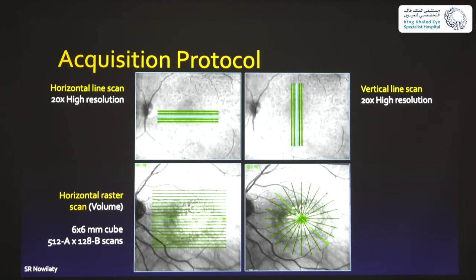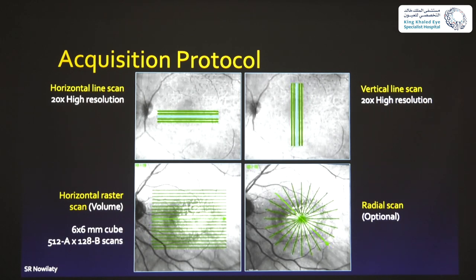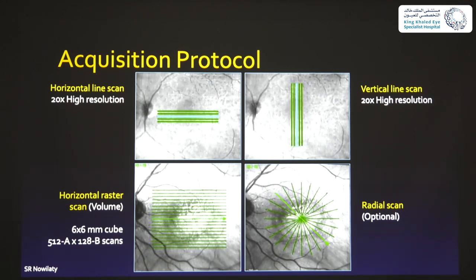The software extrapolates thicknesses between lines to give you an idea of retinal thickness and generates cubes for volume analysis. You can also do a radial scan — scanning every clock hour centered on the point of fixation. This is particularly important if you suspect a macular hole: if the hole is between two horizontal lines you may miss it, but scanning from every angle around the fixation point means you're likely to see it in at least one or two scans.